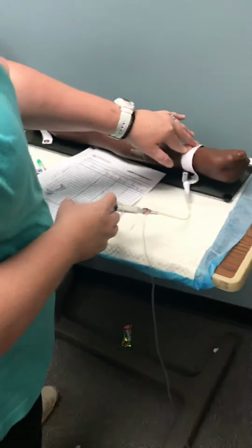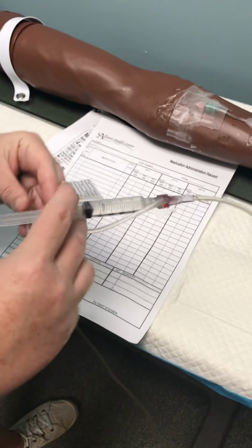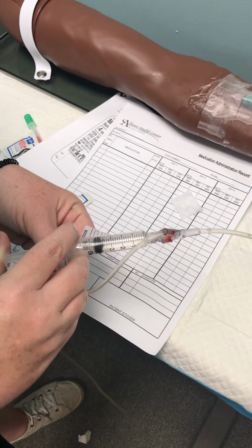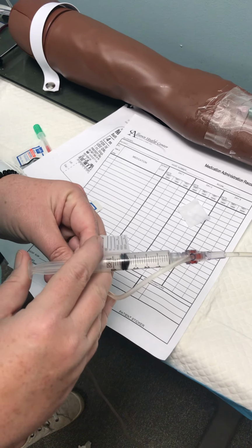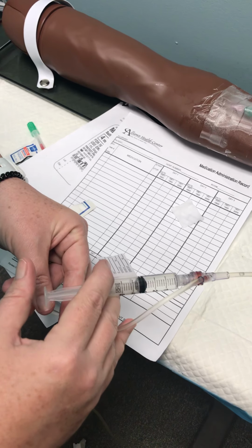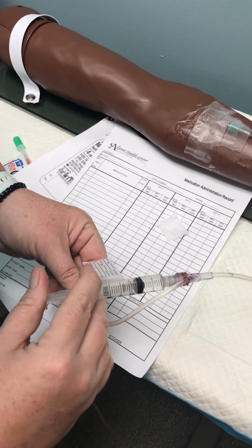Okay. Are you ready, Mr. John Doe? He's ready, so we're going to give him his medicine. Okay. We're going to clamp it. We're going to give 1 milliliter. Okay, going to release. A minute has passed, so we're going to give another. Another has passed. So we're going to give another. And we're going to release.